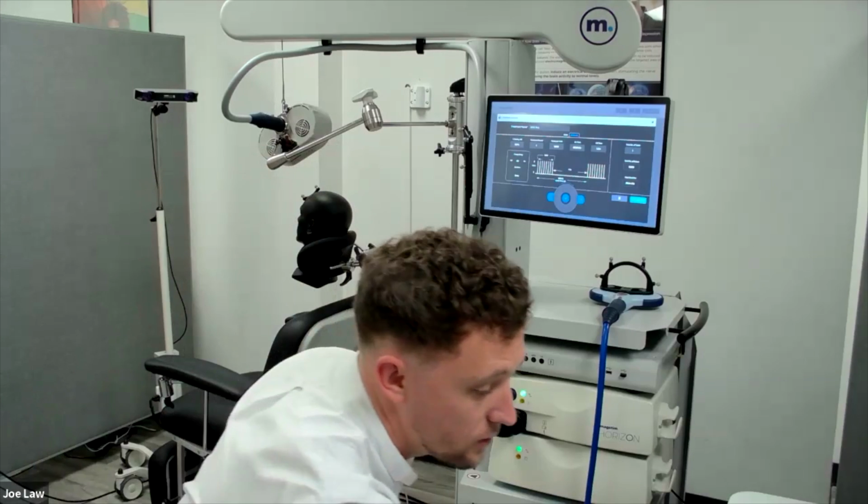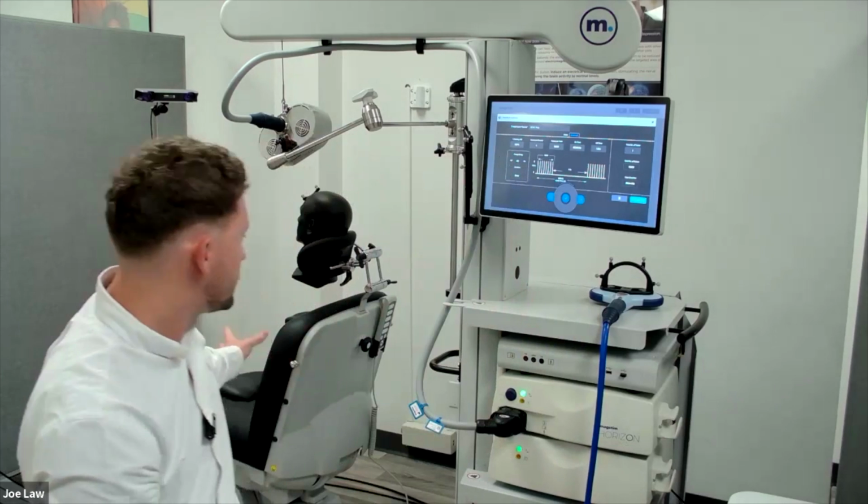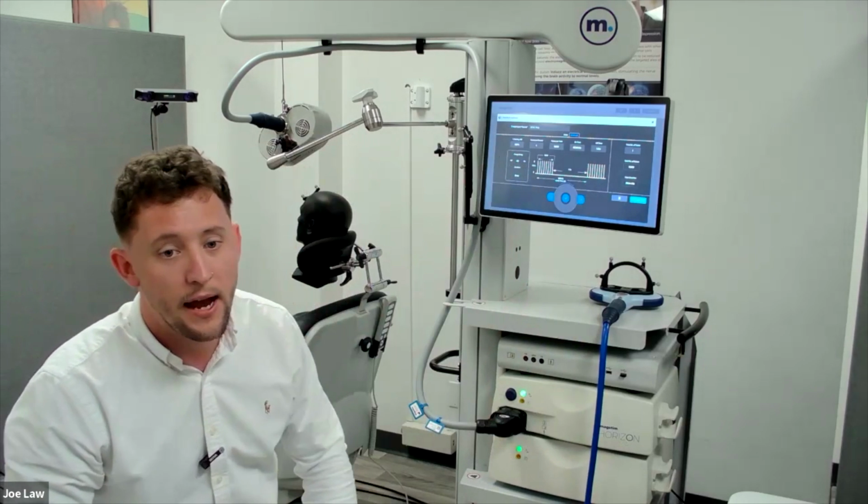Fantastic. Another chair question, Joe. Can patients interchange chairs without having to recheck MTs or input the patient's info into the system? Yeah, great question. The way this head tracker works is it's only looking at where this is in space. So if you've done the anatomical landmarks correctly, you can move the patient in the chair anywhere you want. I generally suggest don't do large movements just for error, but no, you're fine. If you want to move your patient after doing anatomical landmarks, for example, you can do that.